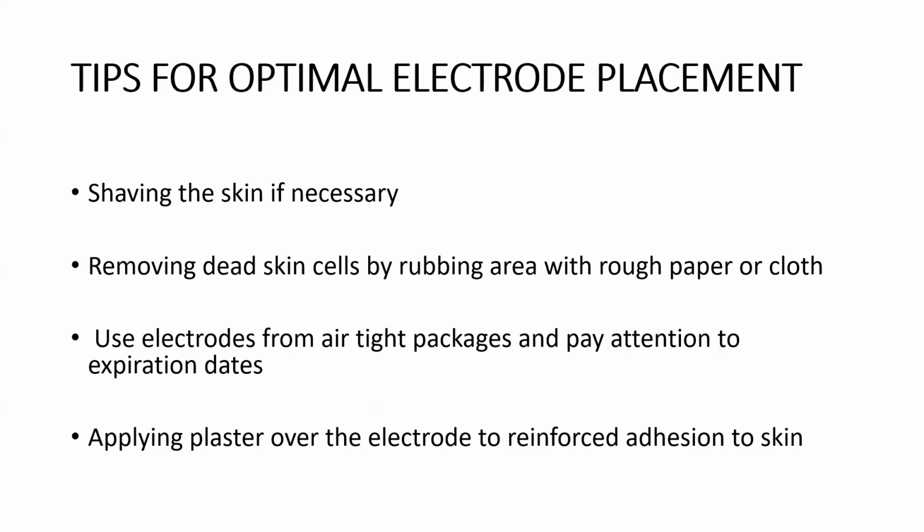And then if there are dead cells around it, or the skin is oily, that area should be cleaned with a rough paper or cloth. And then it's important to use good quality electrodes from an airtight package, and pay attention to expiration dates. We don't want to use electrodes that will not firmly attach to the skin.